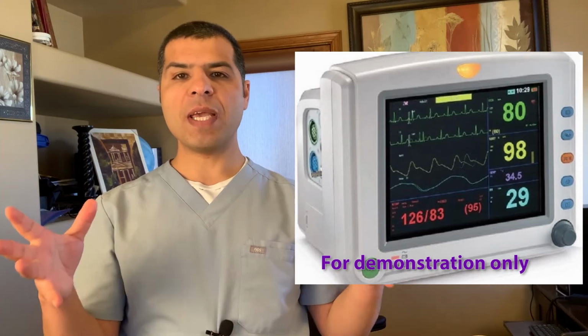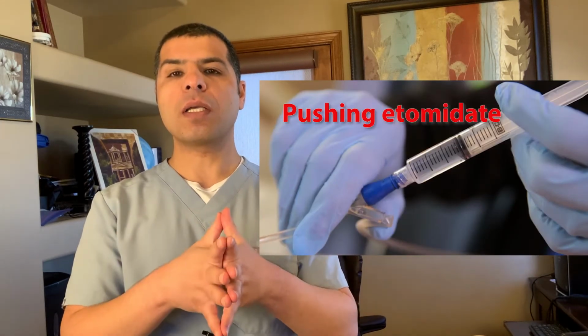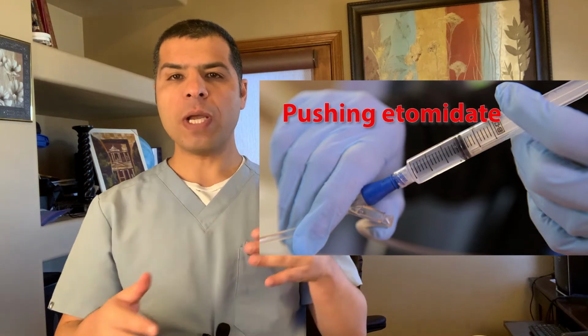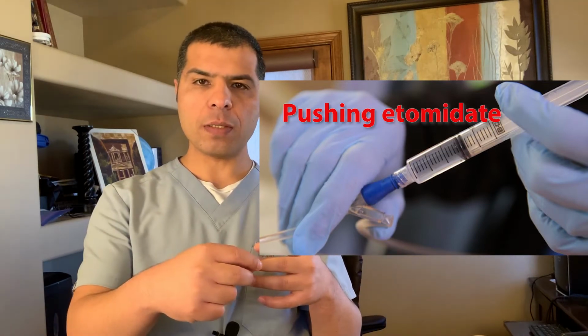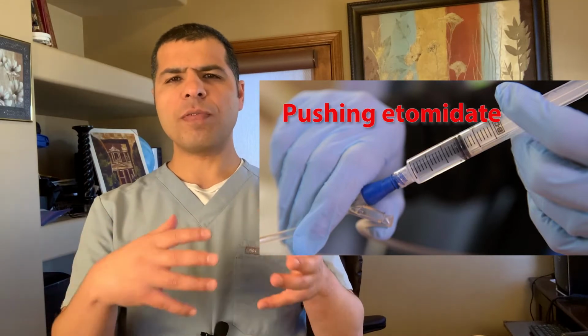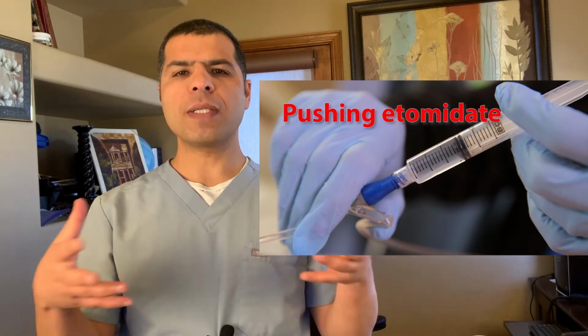Next, I looked at the monitor. The patient's saturation was barely 81%. That's the best we could achieve. I told the nurse at that moment to go ahead and push the etomidate, the medication I picked. I told, go ahead and push etomidate now. Usually when they push etomidate, they flush it after. That takes around 15 to 20 seconds. By that time, usually the patient starts to get sedated.